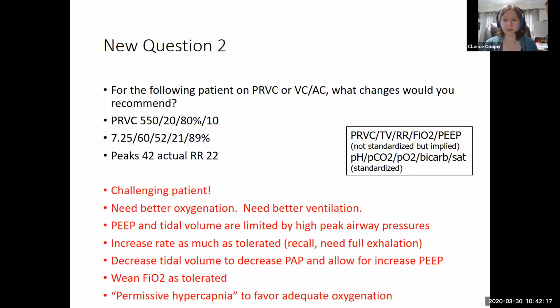Typically when patients are paralyzed, they're put onto a pressure control mode. Really, volume control with pressure limitations or pressure control ultimately accomplish the same thing. They require a lot of constant evaluation by the intensivist, where if you're in a pressure regulated volume control mode, you set the volume and then you're limited as the machine approaches high pressures and limits those volumes, and you make adjustments to your volumes to limit the pressures that you're seeing on the machine.